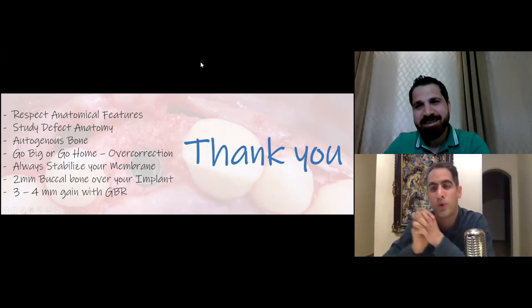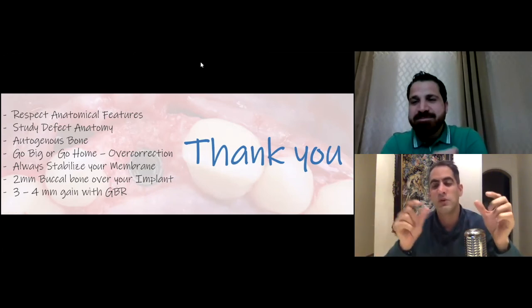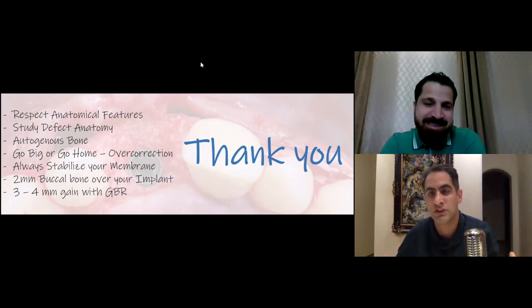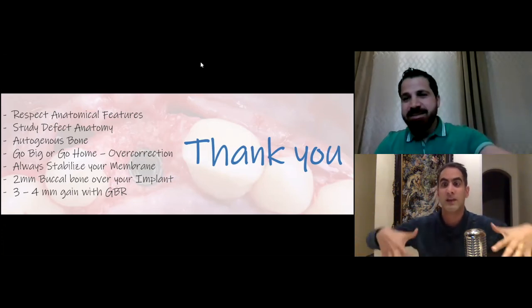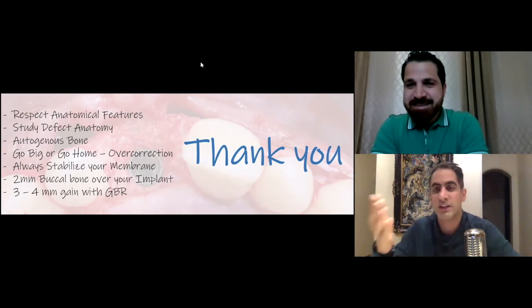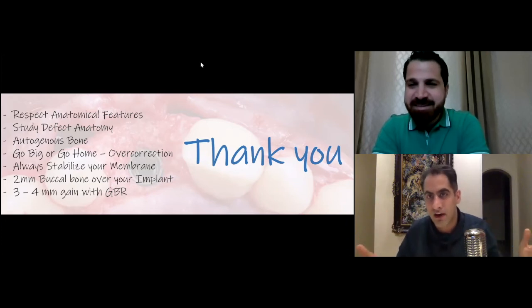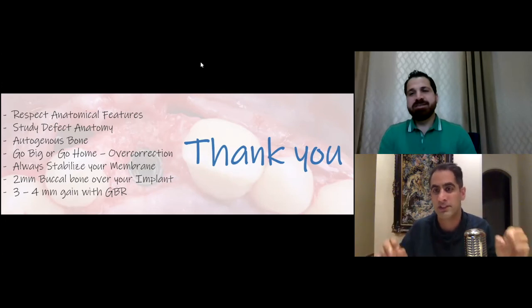And the most important point that I think you mentioned, and I truly agree with that, is when you were talking about how should be the length of the screws out of the bone and don't put longer screws. That's a very key factor, I believe, in this surgery, because so many people think that they can place longer screws so they can gain more bone, and that will cause some exposures and complications. And it's not even necessary, because most of the patients have 2 millimeters of bone, and we want to make it to 6. So only 4 millimeter screw out of the bone can be enough and make the surgery as predictable as possible. So thank you so much for all these great points that you mentioned.